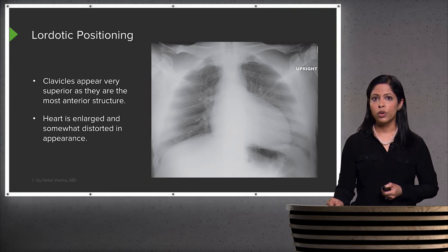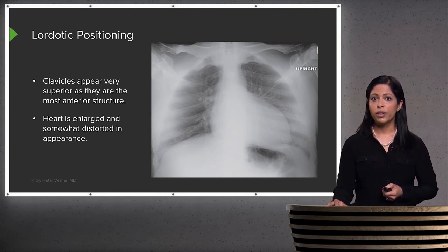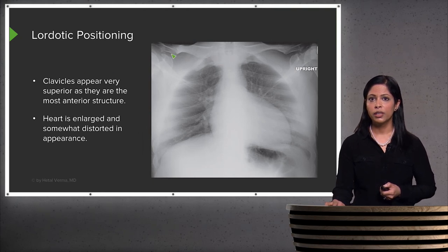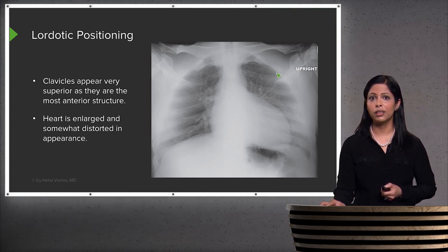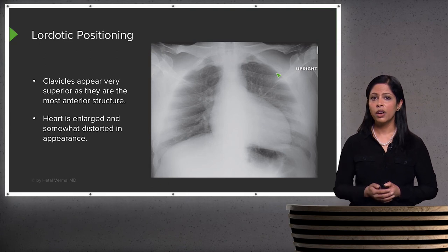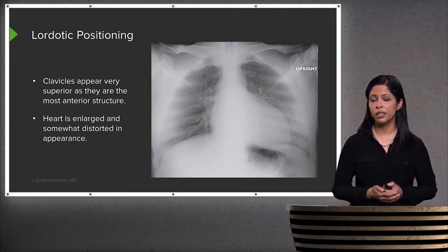This is an actual x-ray in the lordotic position. You can see the clavicles appear very superior because they are the most anterior structure — located way up here rather than in their normal anatomic position. The heart also appears enlarged and somewhat distorted in appearance, again because of this positioning.